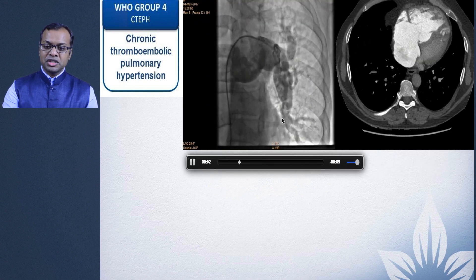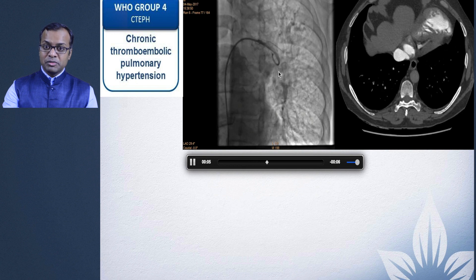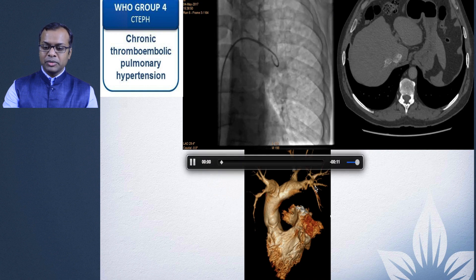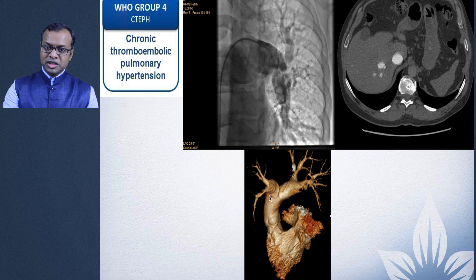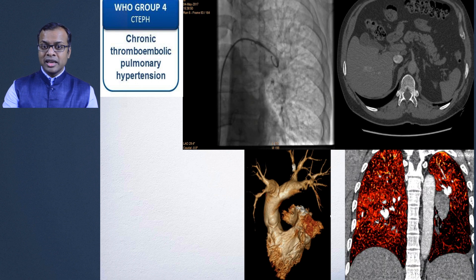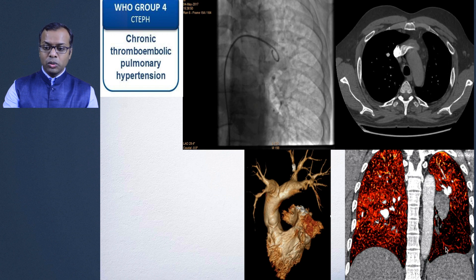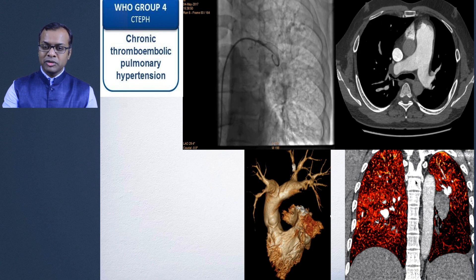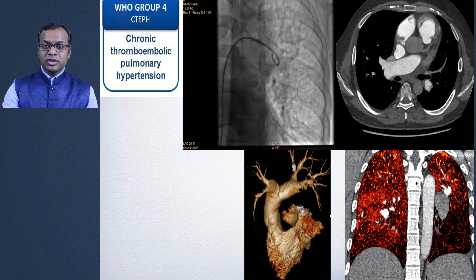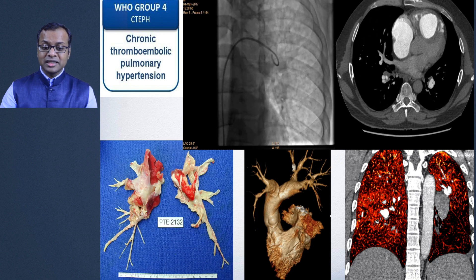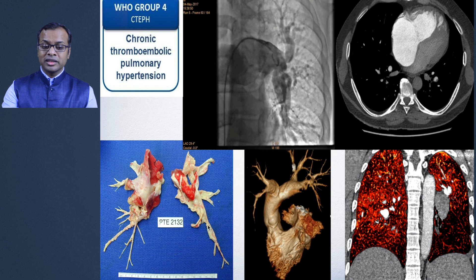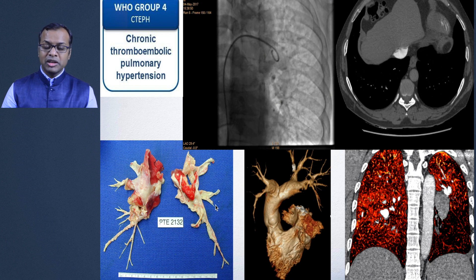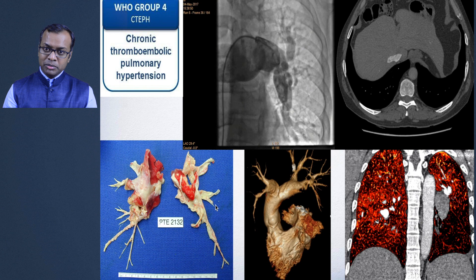On catheter angiography of the same patient, areas of webs and narrowing are nicely demonstrated on 3D MPR views. Dual-energy CT shows reduced perfusion in the left lower lobe with patchy areas of reduced perfusion in the other lung, consistent with CTEPH. Management is pulmonary endarterectomy — the clots are removed from the pulmonary artery and patients do extremely well with a significant drop in pulmonary pressures.